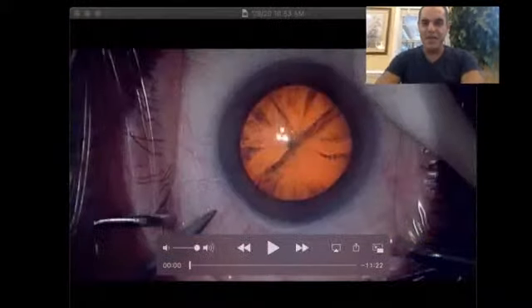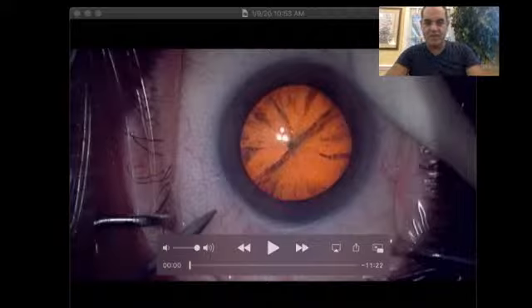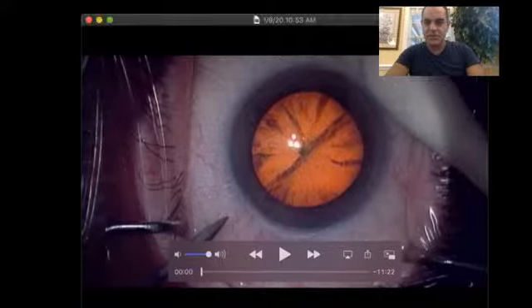Okay, so I'm just going to present one case here of cataract surgery, and we'll go through this, and I'll make commentary as we go through.